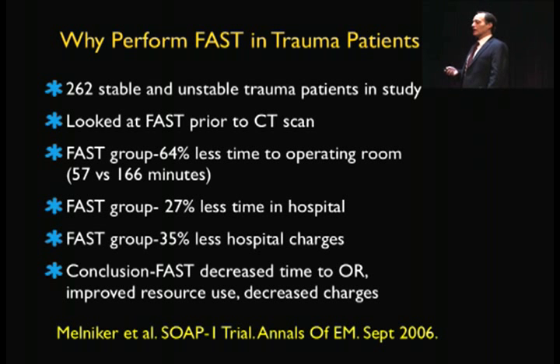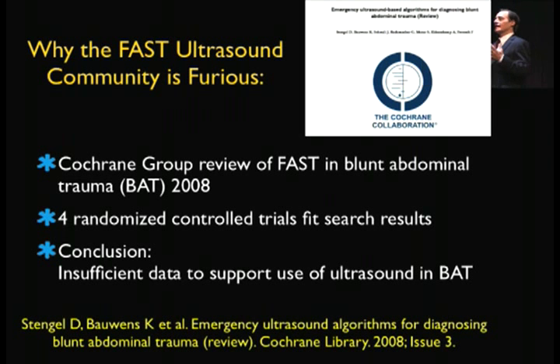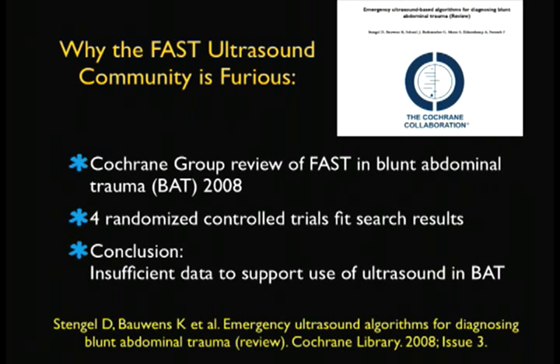Anyway, so the conclusion there was the FAST decreased the time to the OR, improved resource use, and decreased total charges to our patient. Okay, well, an article then came out afterwards making the FAST community very fast and furious. Very furious. We were pissed off. And why was that? The Canadians again.